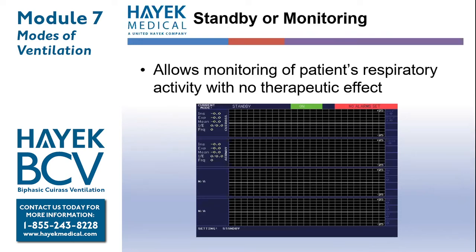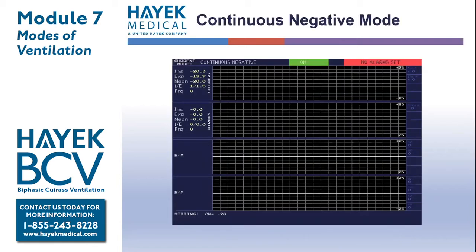Standby or monitoring allows monitoring of the patient's respiratory activity with no therapeutic effect. Continuous negative mode.